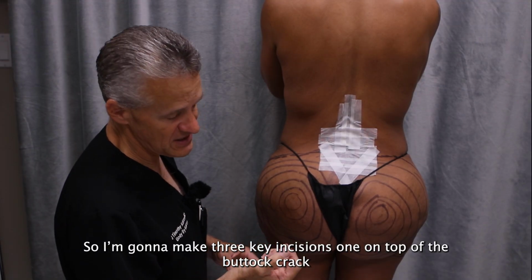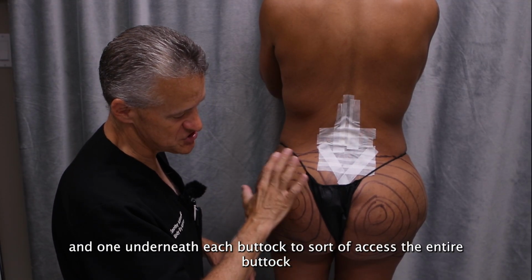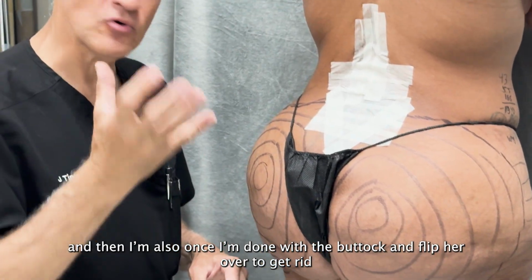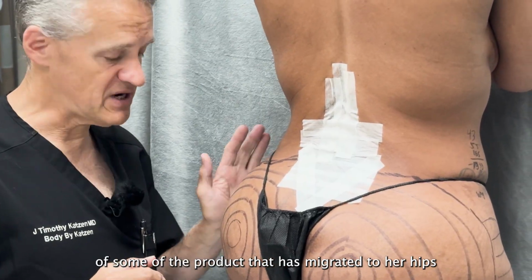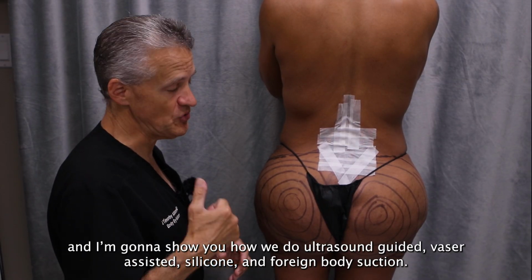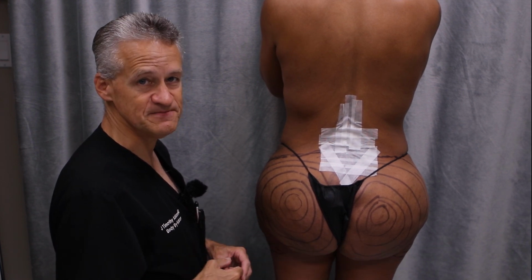So I'm going to make three key incisions, one at the top of the buttock crack and one underneath each buttock to sort of access the entire buttock. And then I'm also, once I'm done with the buttock, going to flip her over to get rid of some of the product that's migrated to her hips as well as into the groin. So let's go to the operating room and I'll show you how we do ultrasound guided, Vaser assisted, silicone and foreign body suction.